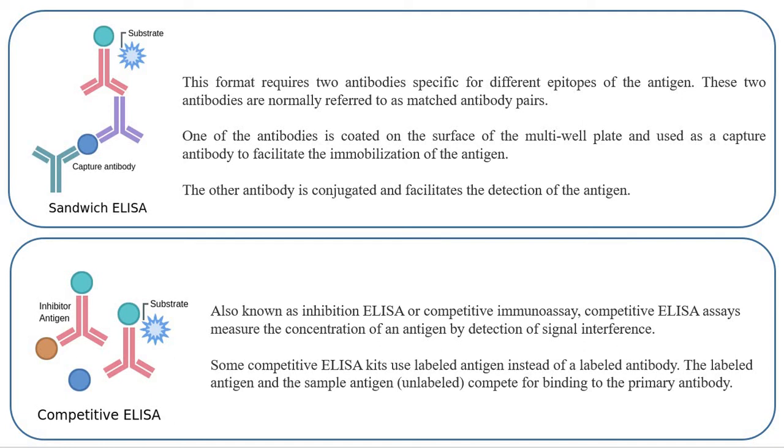chemiluminescence, and electrochemiluminescence. Flow cytometric analysis is the most commonly employed multiplex ELISA method and is performed using bead conjugated antibody. Typically, a great number of cytokines can be measured at a time by use of flow cytometry and bead conjugated antibody compared to other antibodies.